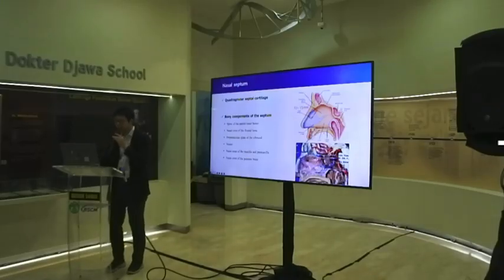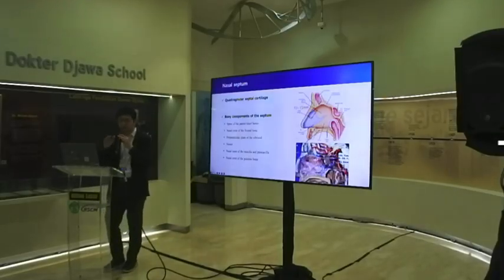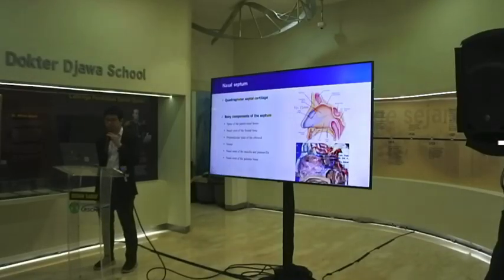This diagram also shows key dimensions. We should keep 1 to 1.5 centimeters of the perpendicular plate when cutting the bone, because if you cut most of the perpendicular plate and do not leave some bone, you will make a saddle nose. So that is very important for the endoscopic endonasal approach.